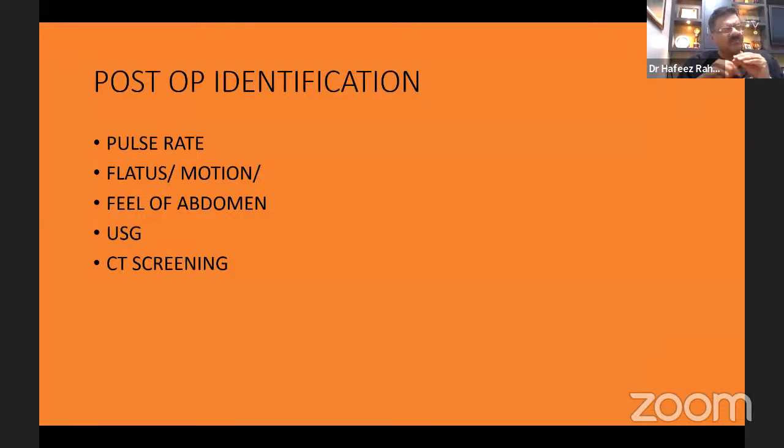On ultrasound, the most important or the only thing you see is basically a lot of fluid outside the bowel, in the peritoneal cavity. In our cases, we do not wash the peritoneal cavity at all. We just suck out the blood, to prevent adhesions, because washing, I believe, can produce more adhesions. So there will not be any fluid in the abdominal cavity in our cases.